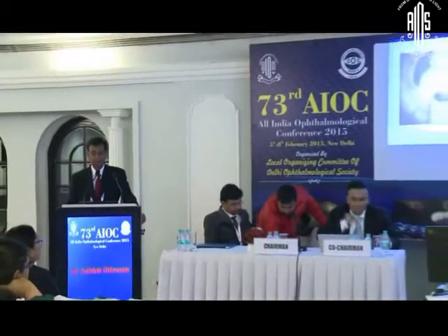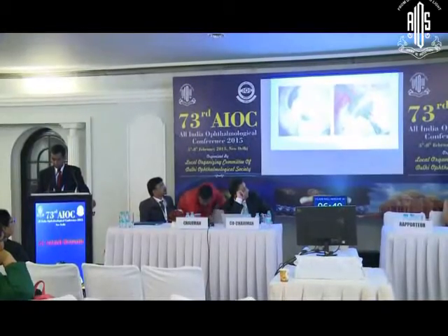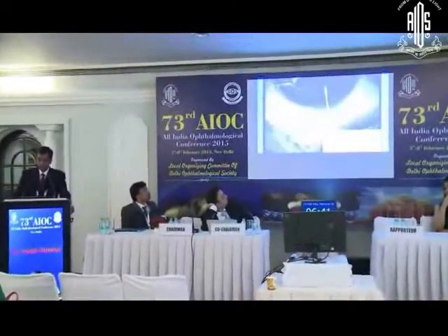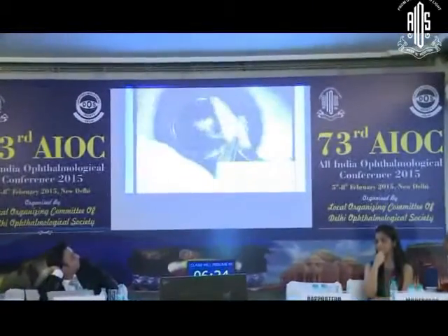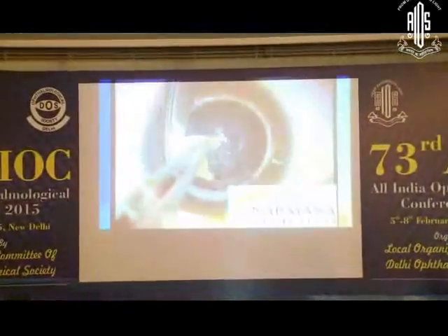Now, what is it we want to achieve? We want to create a perfect big bubble wherein the separation of the posteriormost stromal fibers from the Descemet's occurs. I'll just show you a video as to how the correct big bubble has to be achieved. We just mark the partial stromal cornea and then just use the air, and that's the one which is in the right plane. Once the big bubble is achieved, we just remove the anterior stromal fibers.